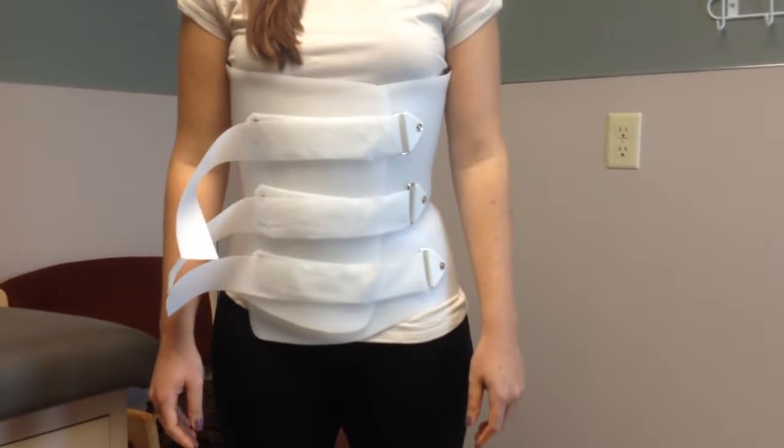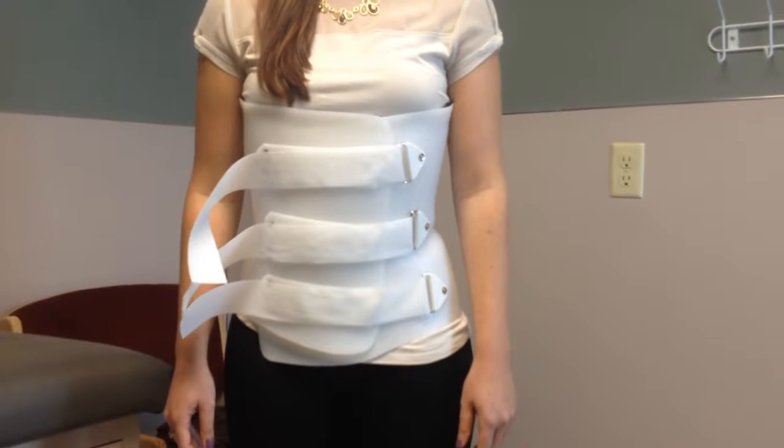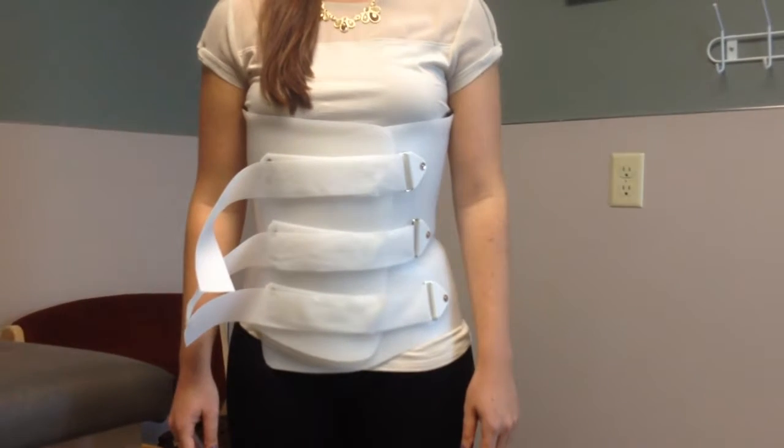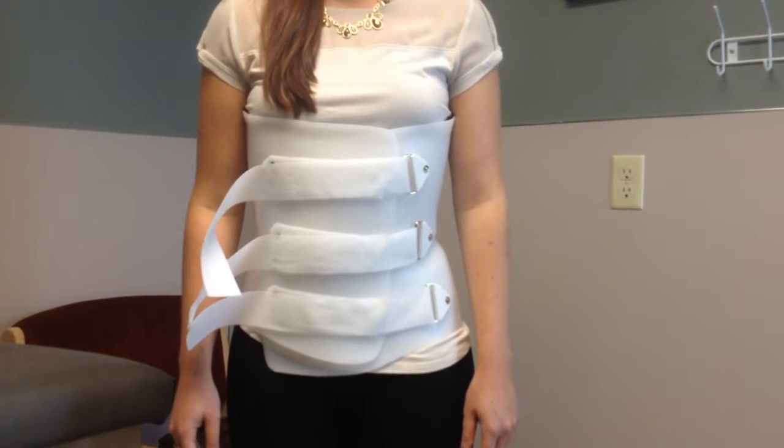Here is a custom LSO. LSO stands for lumbosacral orthosis, as opposed to a TLSO, which would go higher up on the chest area.